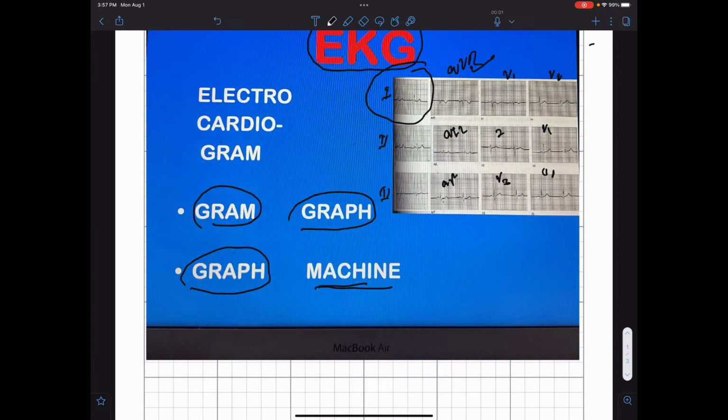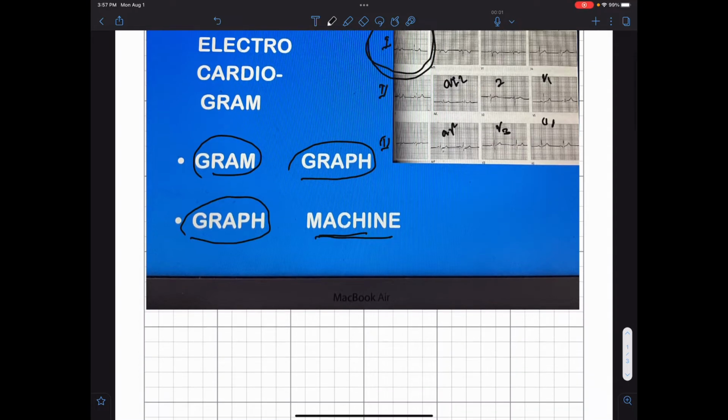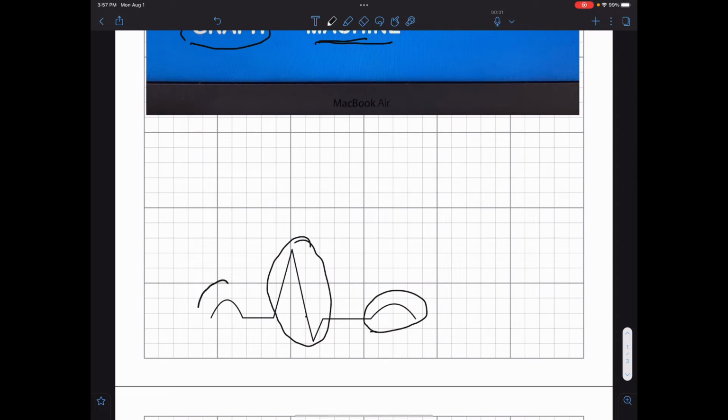Now, the different leads, as we have discussed, there are 12 leads. All of these leads have some common features, that they have a few waves. Like if we study the waves of lead 1, it consists of the first wave, which is known as the P wave. So the P wave is the first upward deflection on the ECG after the isoelectric line. Then this is followed by a flat line, this isoelectric line, which is known as the PR segment.